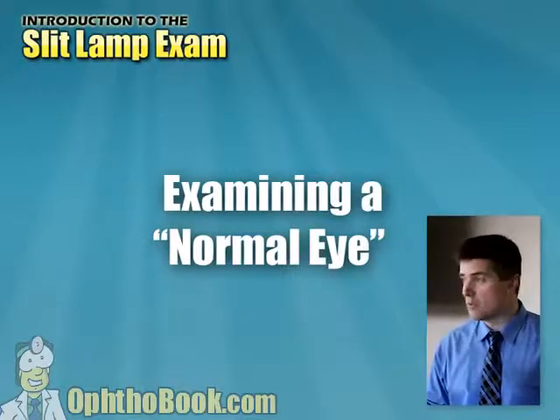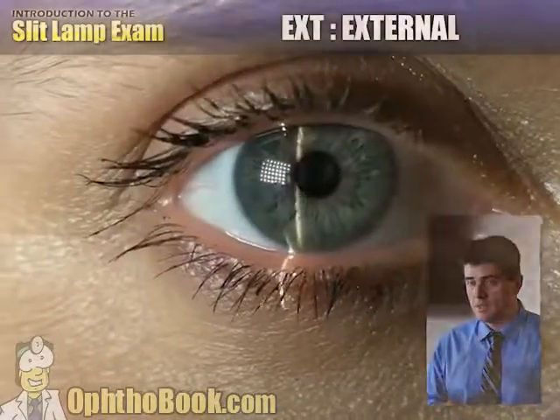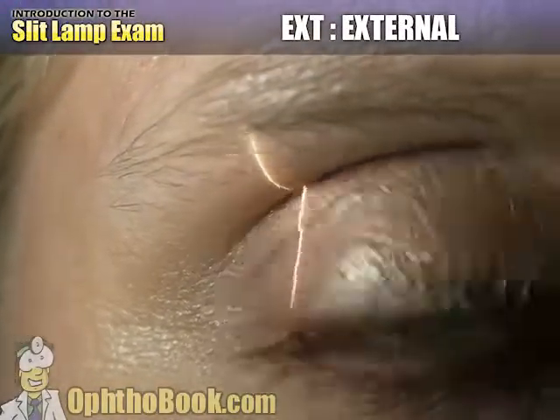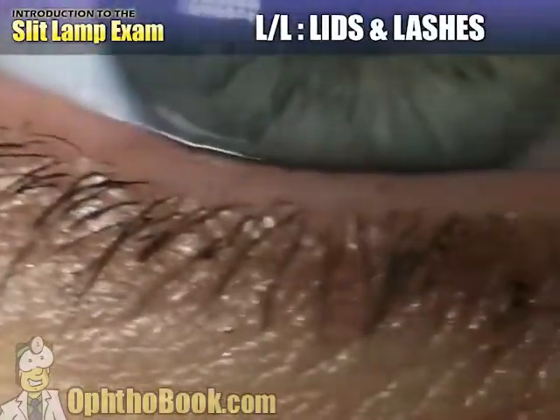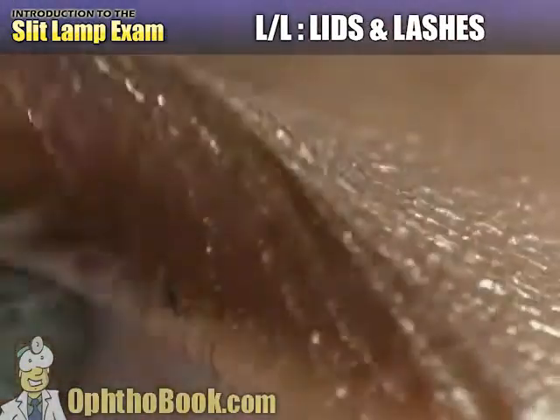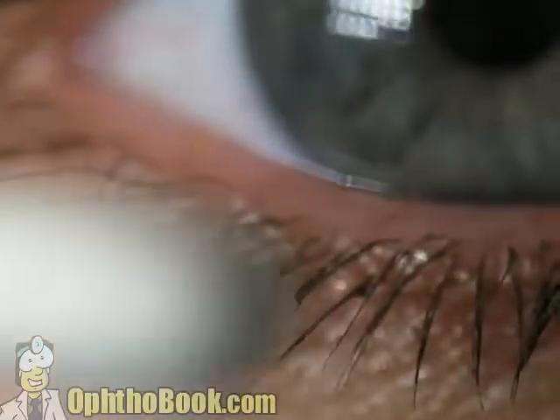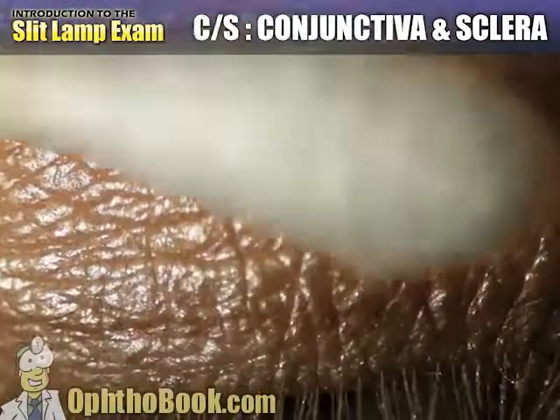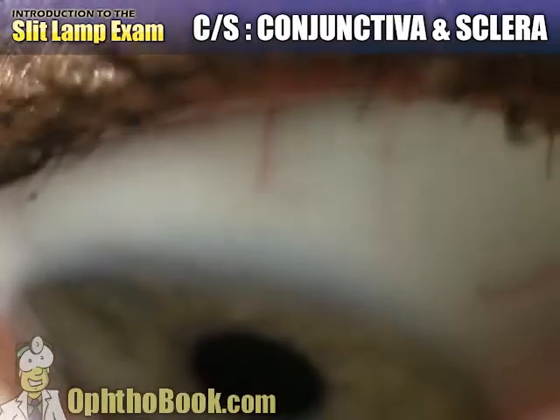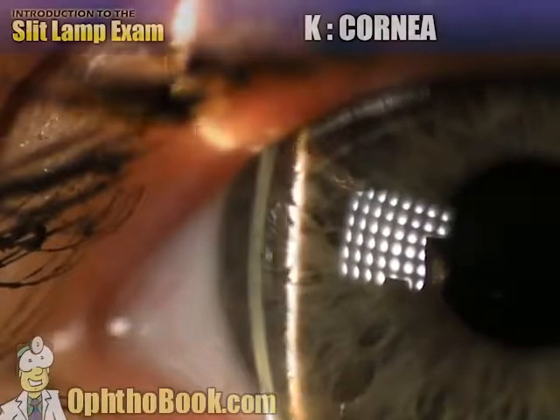Let's move on to a normal eye and repeat ourselves to see what normal looks like. Once again we start with our external exam, looking around the eye — the brow above, sweep across, the nose, looking down at the cheek. Everything looks normal here. Look at our lids and lashes, look at our lid margins, look at our lash line — within normal limits, some makeup in the corner but that looks fine. I always flip the lower eyelid down to make sure there are no lesions there. The conjunctiva and sclera — I have the patient look up, down, left, and right so we don't miss anything.